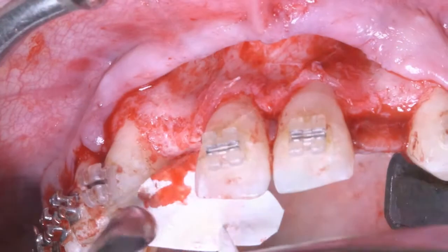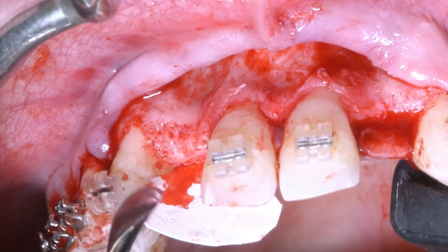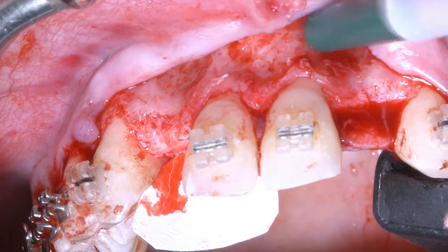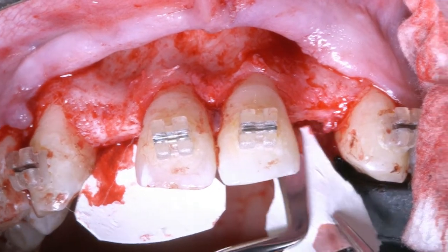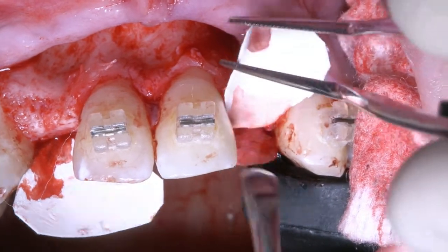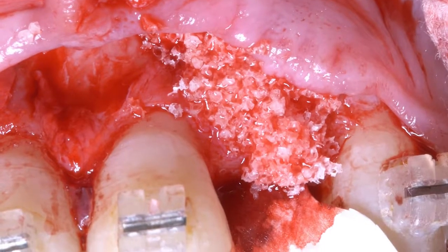So here I did the full thickness flap, no vertical releasing incision, and the bone was harvested from the anterior nasal spine mixed with biomaterials. I used then the Creos Xenoprotect, which is a resorbable collagen membrane, and I don't need to use pins or screws because I'm dealing with a self-containing defect. So this is really a straightforward case.